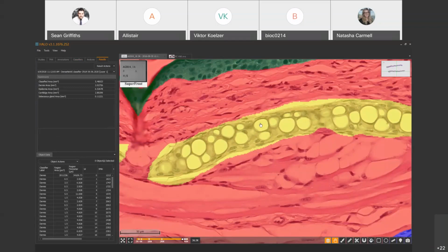So as long as I stick to the format that Halo requires, we can visualize the output of my trained models just as right now? I don't know. Difficult one to answer. I've never seen that in practice. So I guess if I find the required information, I can also pose the question for you about outputs. That's great. Thank you very much.